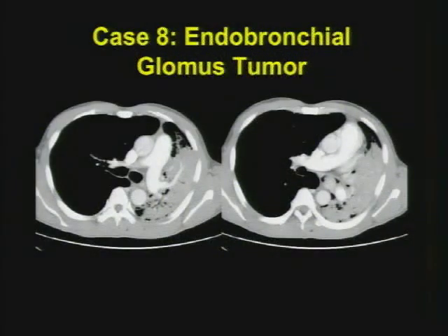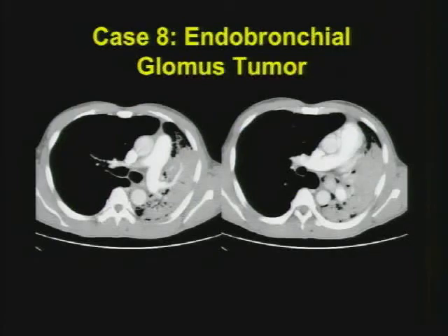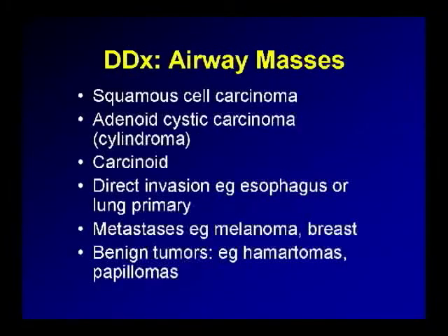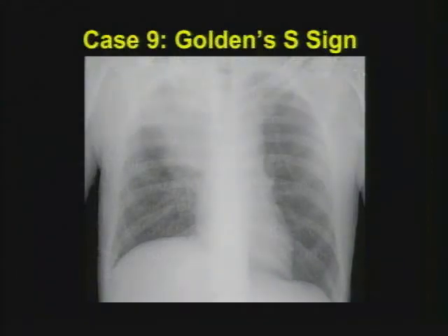Case number eight: an endobronchial glomus tumor — not something you'd expect on a rational differential. Notice this endobronchial mass with post-obstructive atelectasis and ipsilateral shift of mediastinal contents — it's quite vascular in appearance with a lot of enhancement. The things I'd think of would be vascular metastatic disease like breast cancer or melanoma, or carcinoid, which can be quite vascular as well. This happened to be a glomus tumor on surgical resection. This was also a better example of Golden's S sign: hilar mass, bulging, apical atelectasis from post-obstructive volume loss, and that nice curved contour between the collapsing upper lobe and the middle and lower lobes.